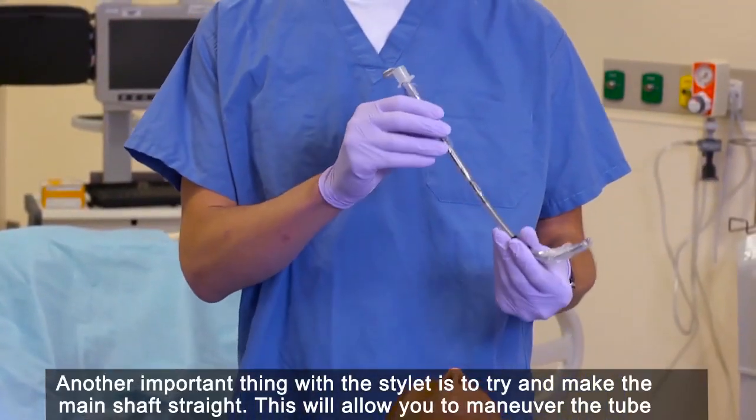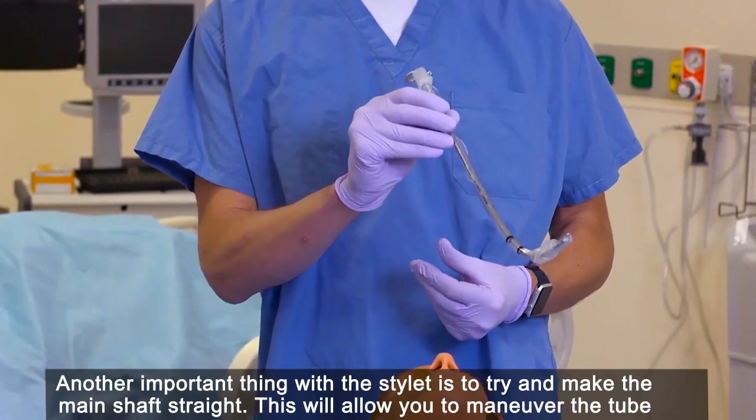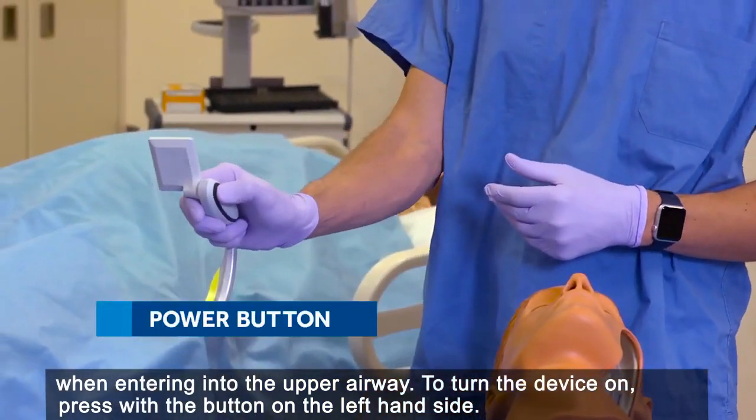Another important thing with the stylet is to try and make the main shaft straight. This will allow you to maneuver the tube when entering into the upper airway. To turn the device on, press the button on the left hand side.